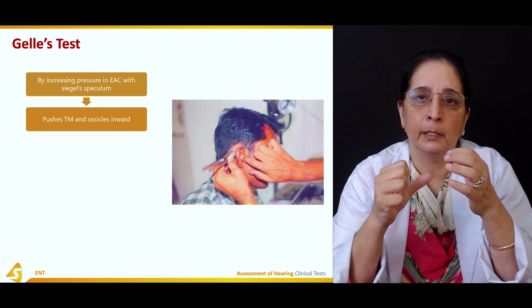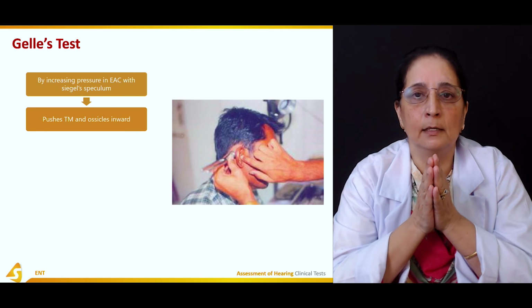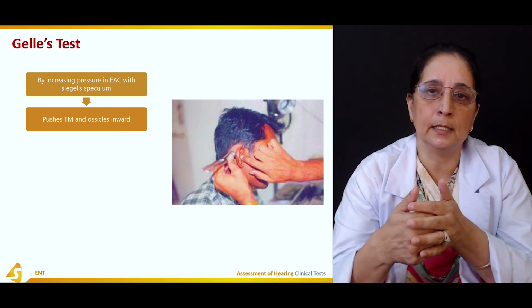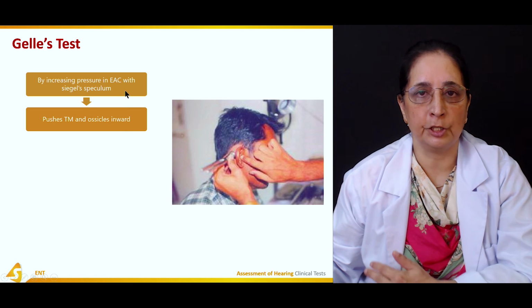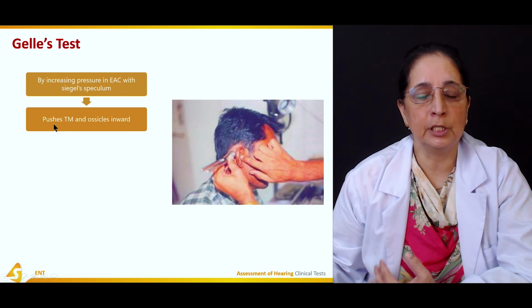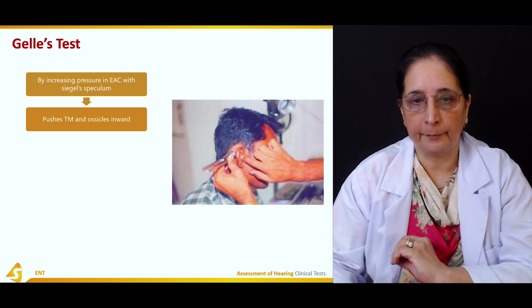You inflate the air, and that increases the pressure inside the external auditory canal. What does this increased pressure do? It pushes the tympanic membrane and ossicles inward.